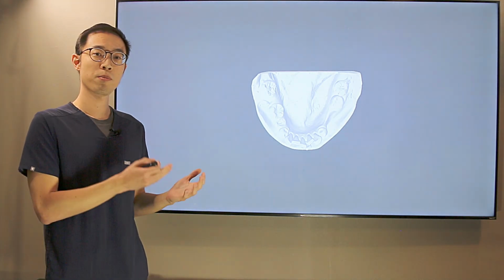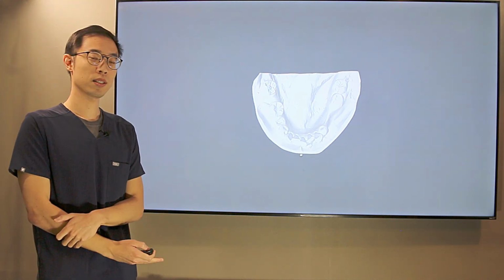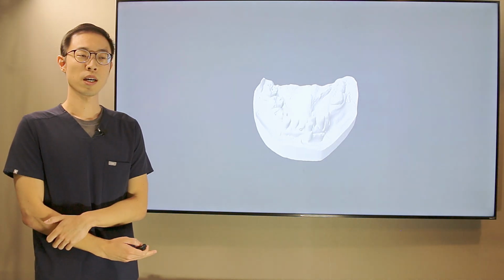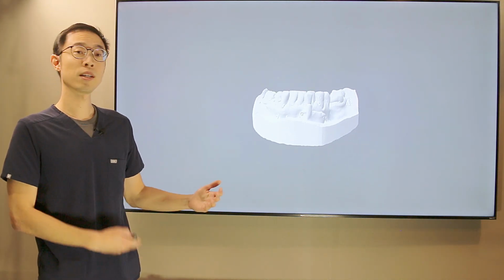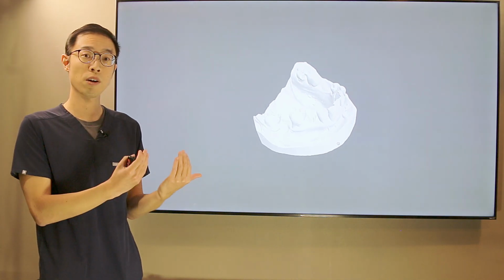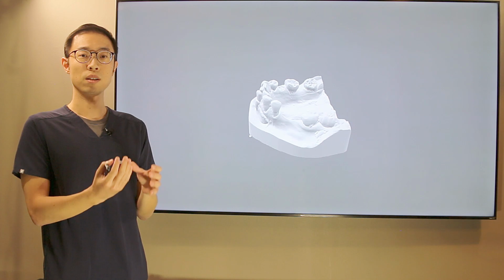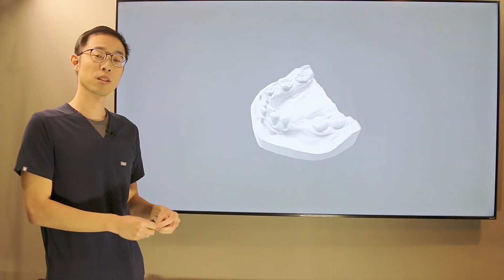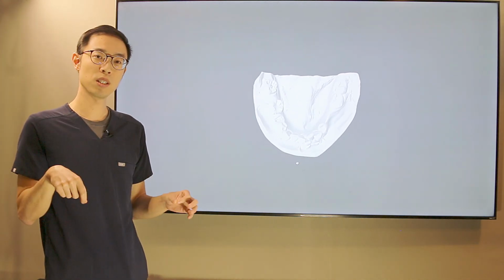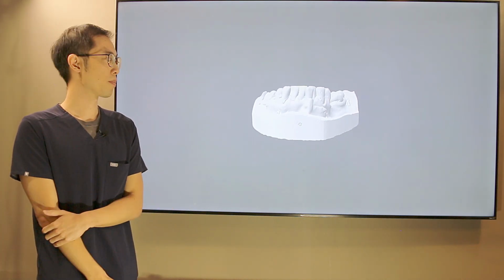So that was the upper arch, and after the upper arch, the patient is now back for doing the same thing on the lower. And so the same thing, we have diagnostics done, we make an impression, we can digitize it, and so we can plan the new positions of the teeth, because you can see here that the teeth are crooked and crowded, and so we're unable to use her existing teeth as a guide for where the implants are supposed to be. We need to make a new set of teeth in new positions and then plan the implants in those positions.